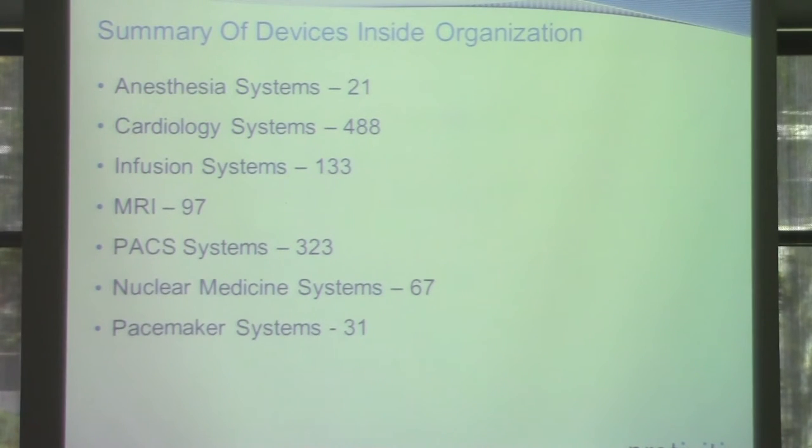So I think this is something that I've clearly discovered. There are lots of them out there on the internet. Even if you do PACS searches through Shodan right now and just search for PACS, you'll find some of them. That's how medical identity theft happens, because they're very poorly secured on the back end file storage, and it has all of your PHI in it.